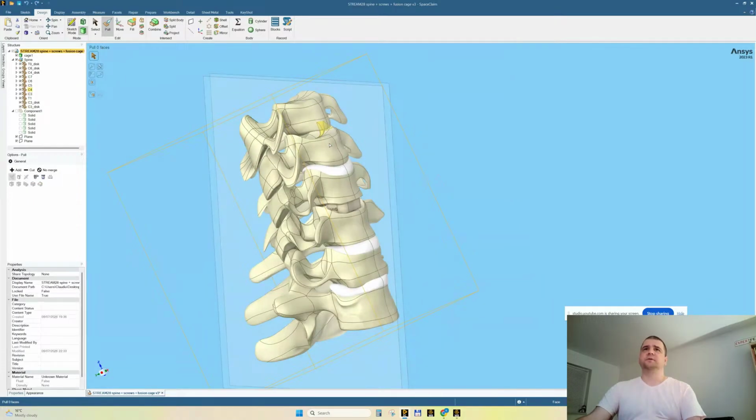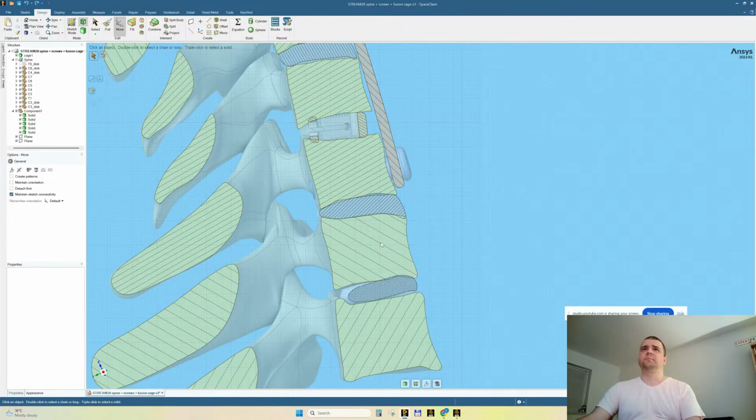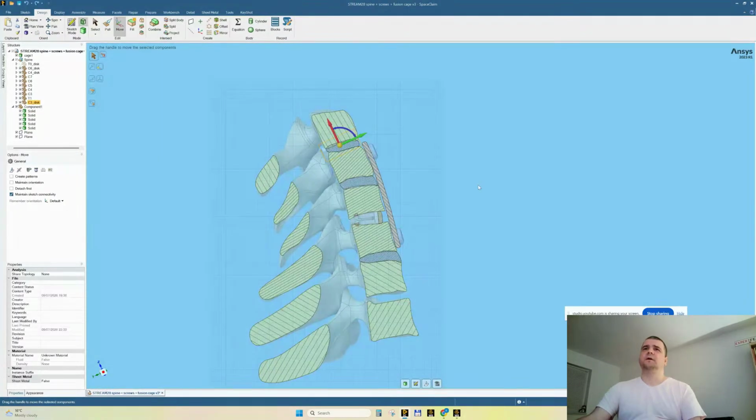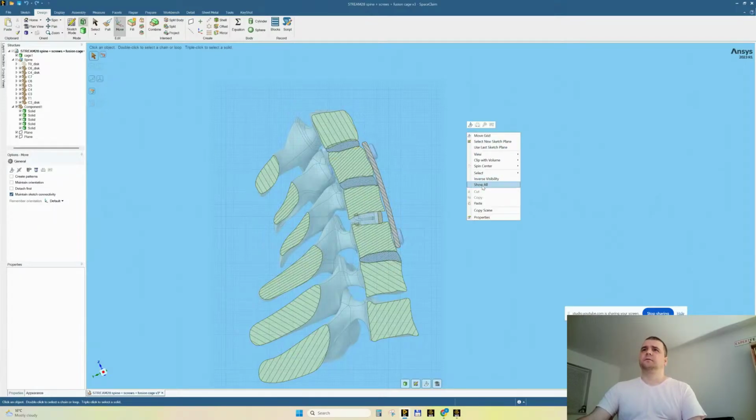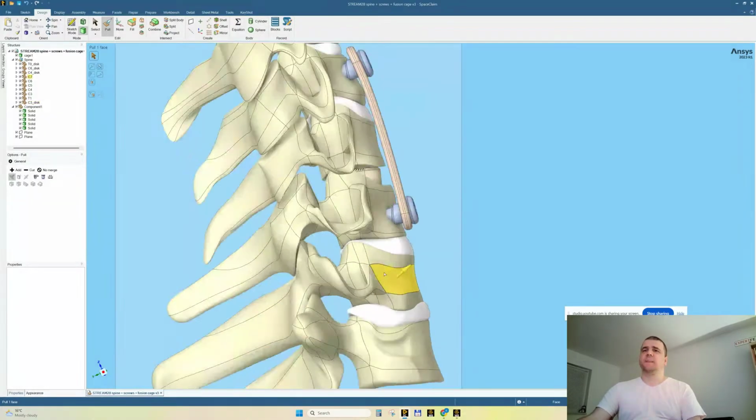What did I do here? Oh, let's undo if possible. I didn't hit control maybe. Yes, we have everything. All right. For a second, I lost the top disk.